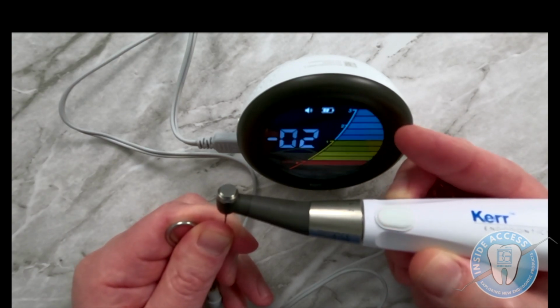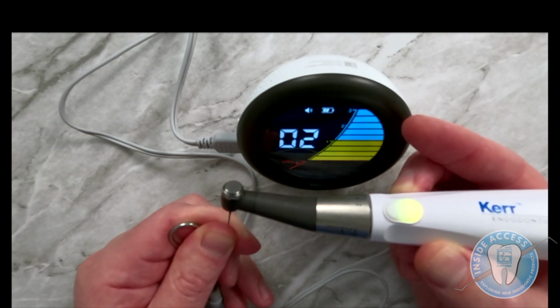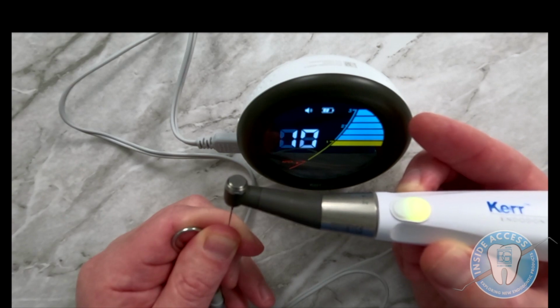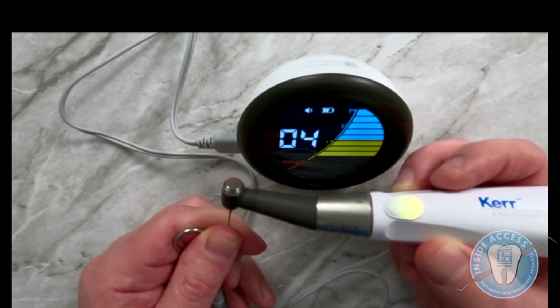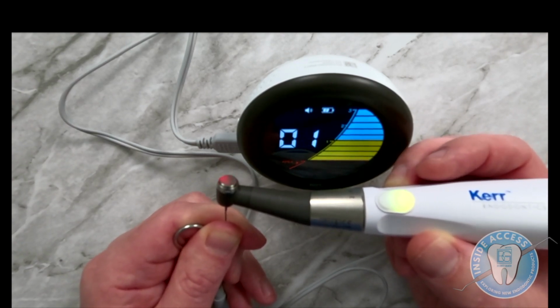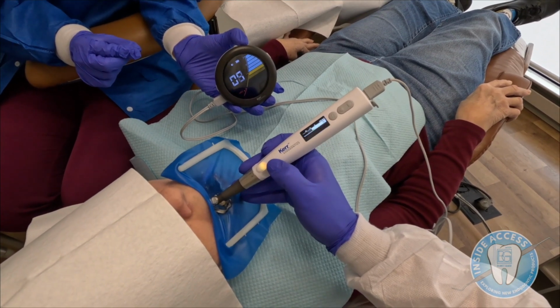When I come back and I back it off, you're going to see how now it's yellow, and then all the way up coronally to where the light will turn blue. So this mimics on the motor what you're seeing on the apex locator. And again, I find this to be incredibly time-saving and helpful to not have to look back at the apex locator so much. So again, I bring it in, real-time apex location.